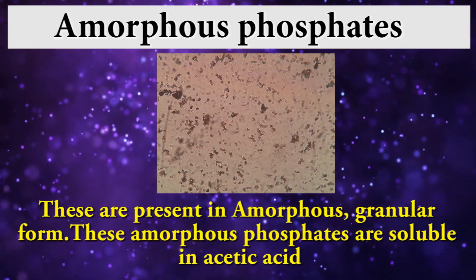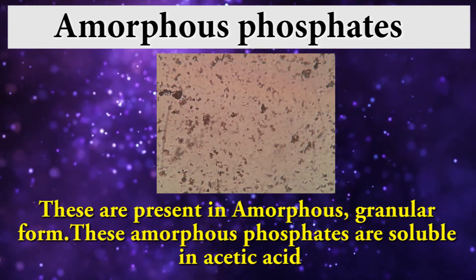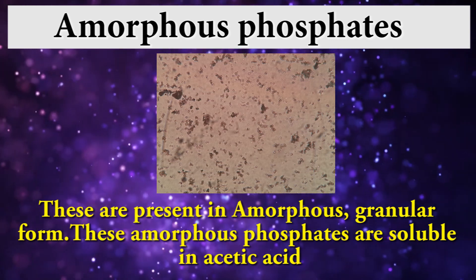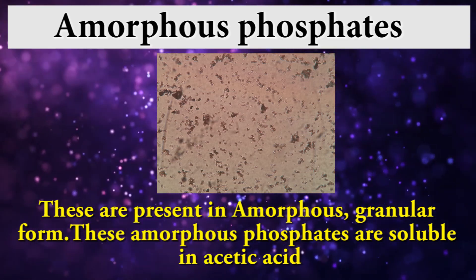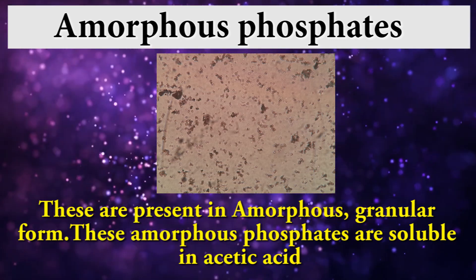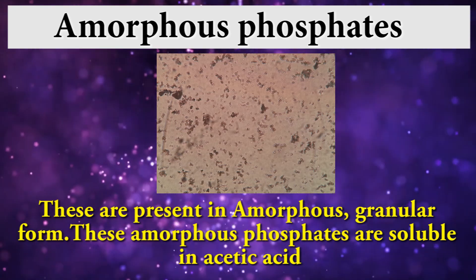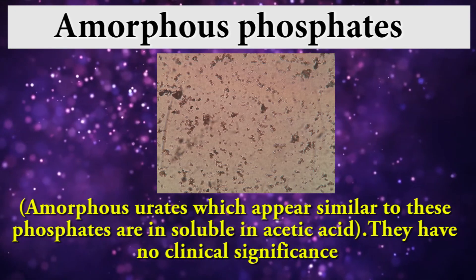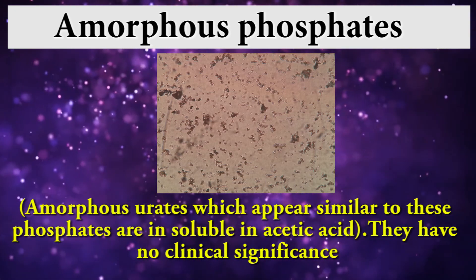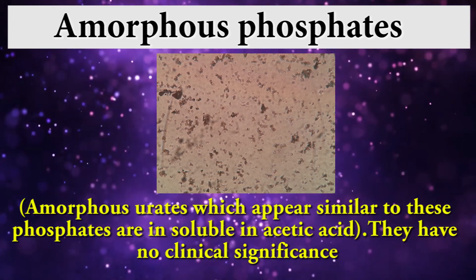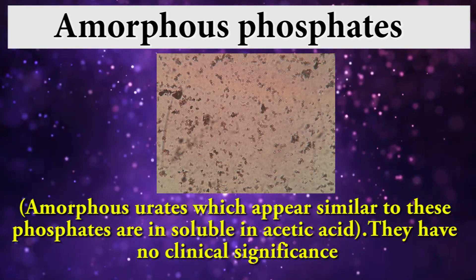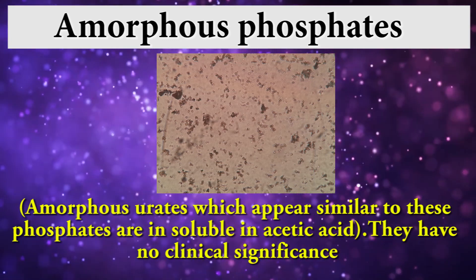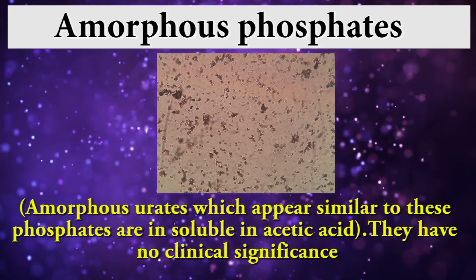Amorphous phosphates: these are present in amorphous granular form. Amorphous phosphates are soluble in acetic acid. Note that amorphous urates, which appear similar, are insoluble in acetic acid. Amorphous phosphates have no clinical significance.